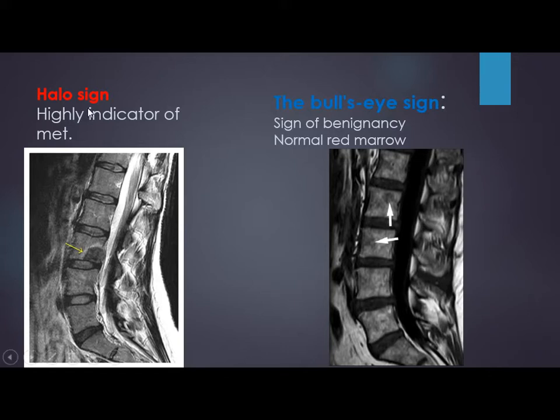Whenever there is a halo sign — lesions surrounded by a high signal curvilinear margin — it is a highly indicative sign of metastasis, on either T1 or T2. While the bulls-eye sign is a sign of benignancy, indicating red marrow. We see two lesions with hypo signal and a small hyperintense dot inside — this is not metastasis, this indicates a benign process.